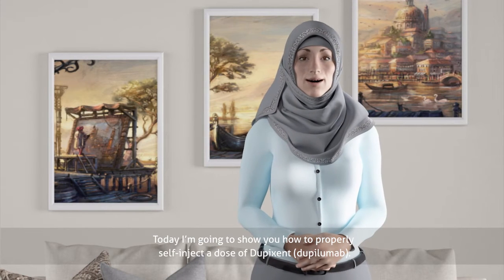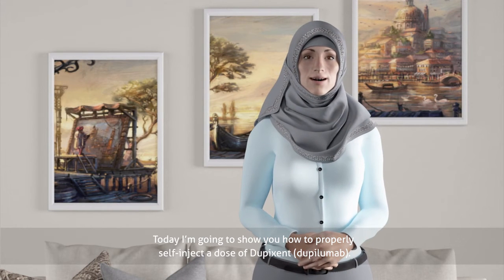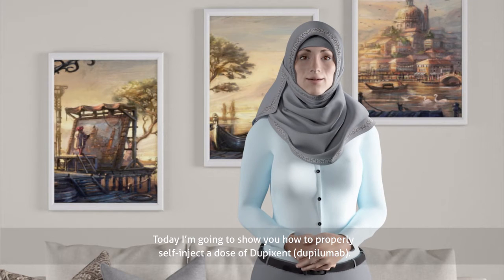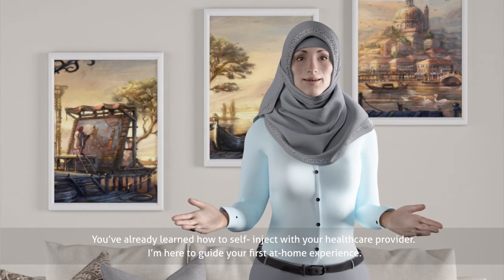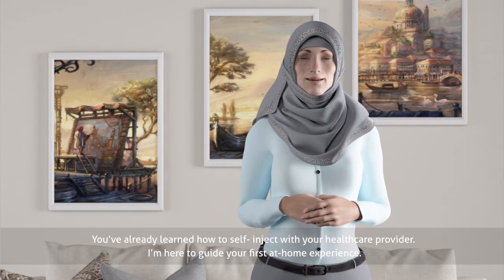Hi there, I'm Laura. Today I'm going to show you how to properly self-inject a dose of Dupixent, dupilumab. You've already learned how to self-inject with your healthcare provider. I'm here to guide your first at-home experience.